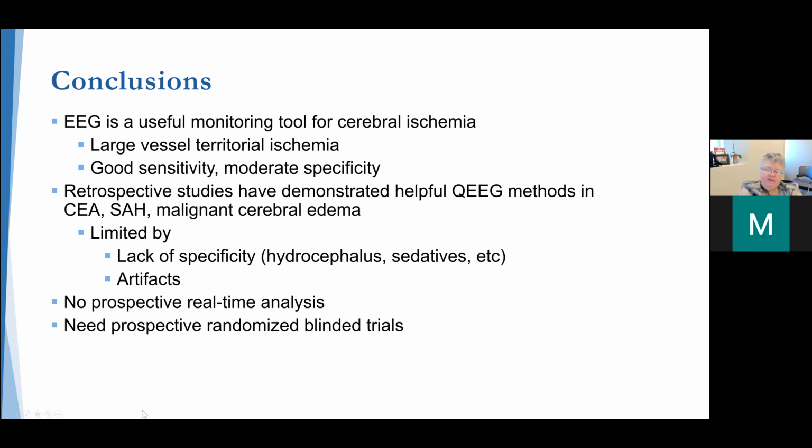So in summary, EEG is a useful monitoring tool for cerebral ischemia. It's most useful looking at large vessel territorial ischemia. And here it has good sensitivity and moderate specificity. You need to rule out other causes before you say that this is related to ischemia.